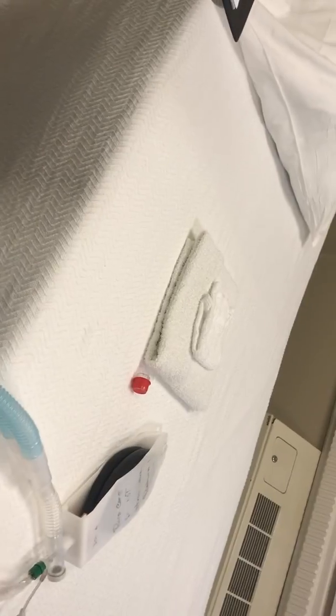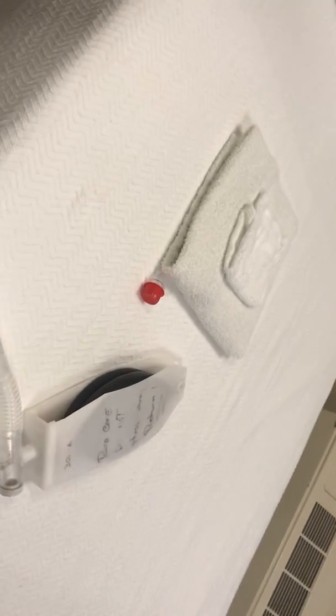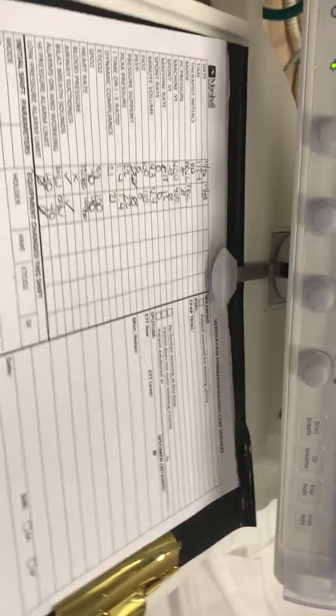For a patient ventilator check, you're going to go in and introduce yourself to the patient. You'd put some gloves on just in case you need the suction, and you're already touching the patient, so just a precaution. You listen to the breath sounds, check their vitals, see if anything's changed there, and then you'd go over to your vent and check it by filling out this sheet. It's done every 2 hours at this facility.